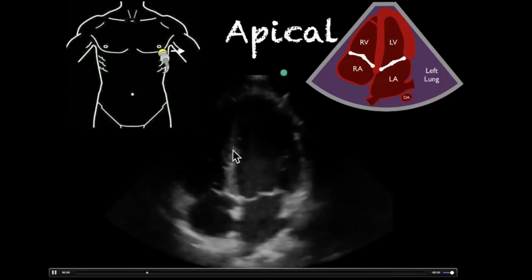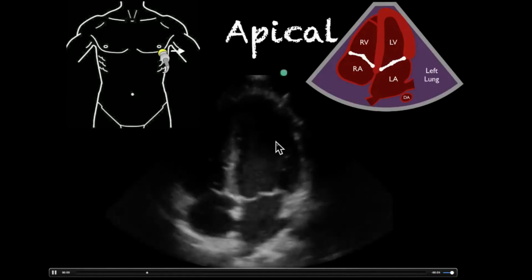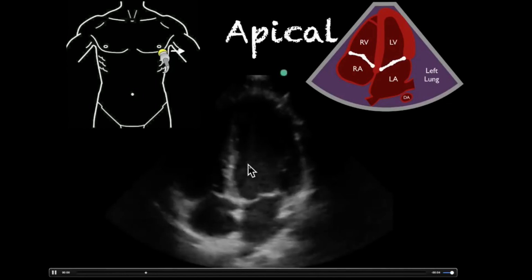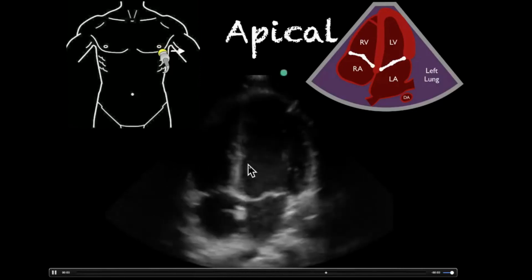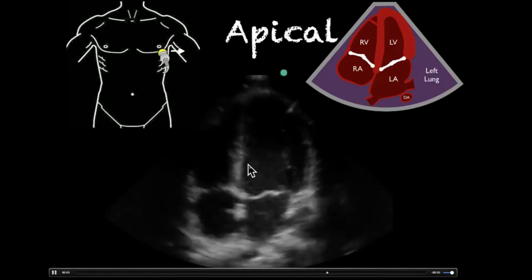The right ventricle should be about 60%, or 0.6, compared to the left ventricle. Some people say it can even be acceptable up to 1, but personally, once they're looking the same size, I consider that to be a dilated right ventricle.